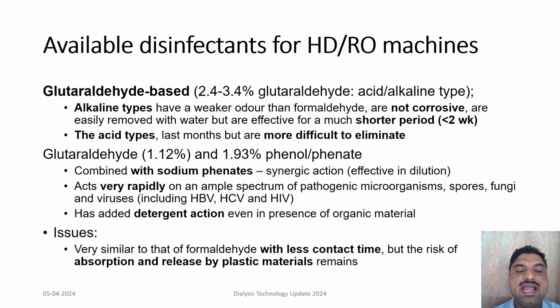It also has an added detergent action even in the presence of organic material. The only problem with these glutaraldehyde formulations is that, like formaldehyde, even with less contact time, they have a risk of absorption and release by the plastic material remains.